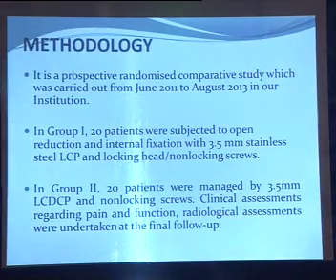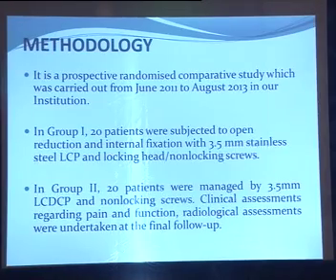The methodology: this is a prospective randomized comparative study, which was carried out from June 2011 to 2013 in our institution. The study was made in two groups. In group 1, 20 patients were subjected to open reduction and fixation with 3.5mm stainless steel LCPs and locking head and non-locking screws. In group 2, 20 patients were managed with 3.5mm LC-DCP and non-locking screws.